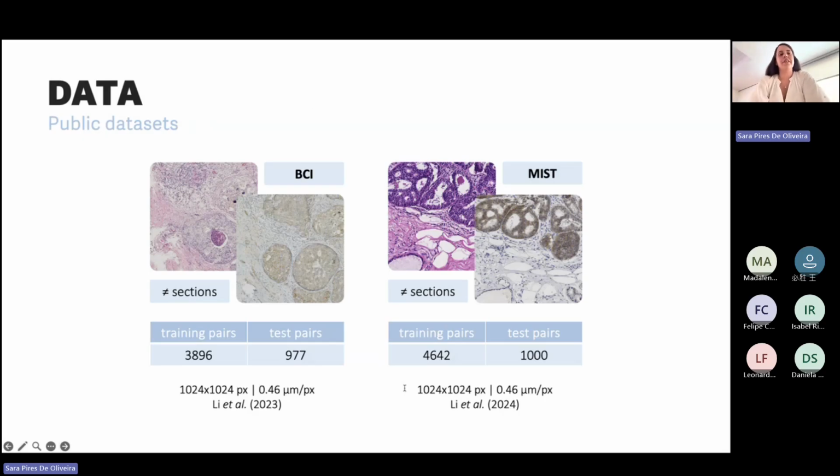One really important detail is that they are basically consecutive slides, just slides retrieved from the archive, which the pathology lab performs as normal. So they correspond to different tissue cuts. Even though they belong to the same tumor sample, they don't correspond exactly.